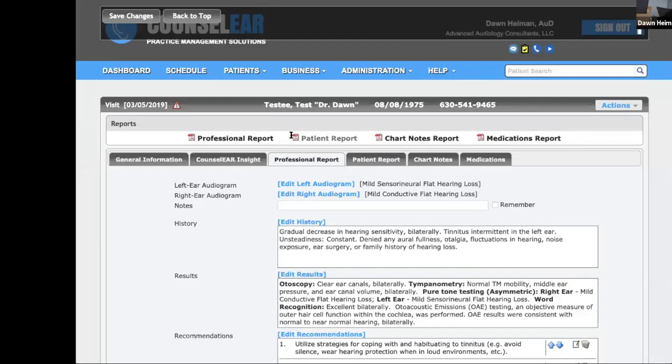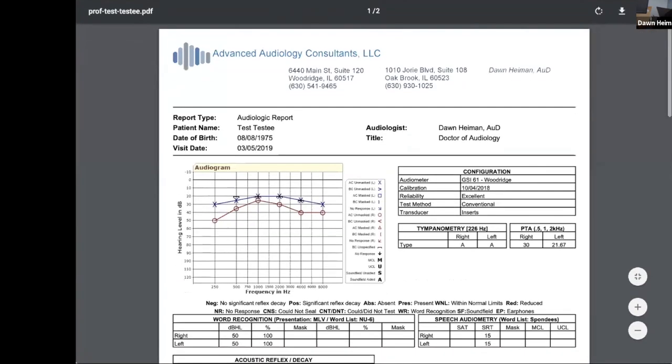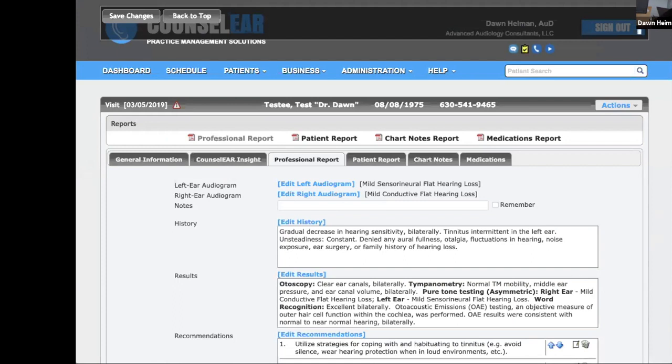So we have our professional report, which we can also send. So straight away, if I have all this done, I make sure, we have big folders. The patients, I tell them as they're walking out of the booth, I'm gonna make sure you get a copy today of your hearing test results. I'm gonna make sure your doctor gets a copy. We are not hiding anything. Right there, I have already instilled so much trust because the guy down the street said he wasn't allowed to have his hearing test results. So I'm making sure I print.